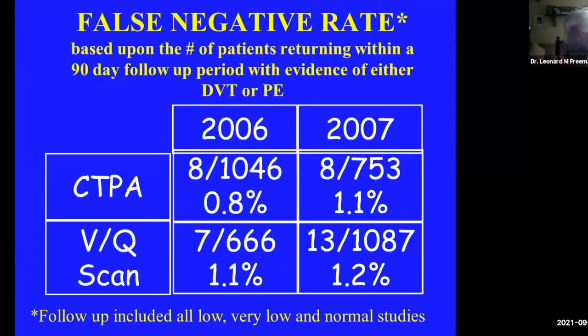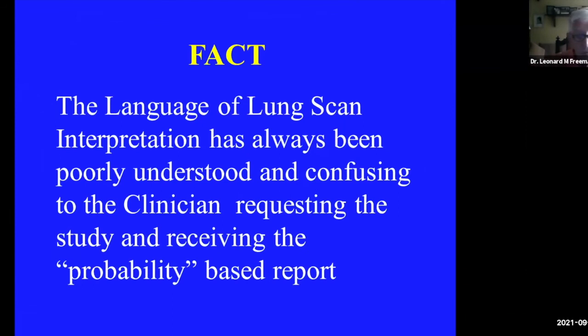And you can see that it's making the switch from 06 to 07. You can see that comparing CT scans to VQ scans, they're essentially identical in terms of the positivity and the negative studies and whatever. So, in our hands, we've always seen that the VQ was certainly as good and in some respects better than the CT scan. But I will say in the United States, certainly most people will be doing CT as their primary exam.